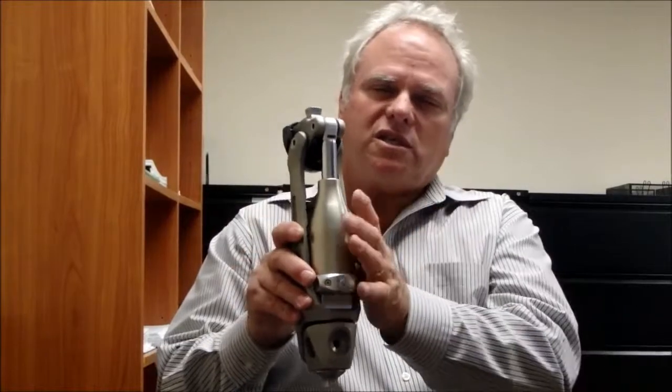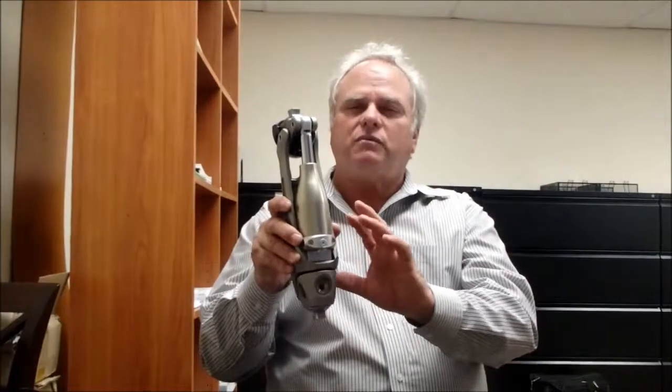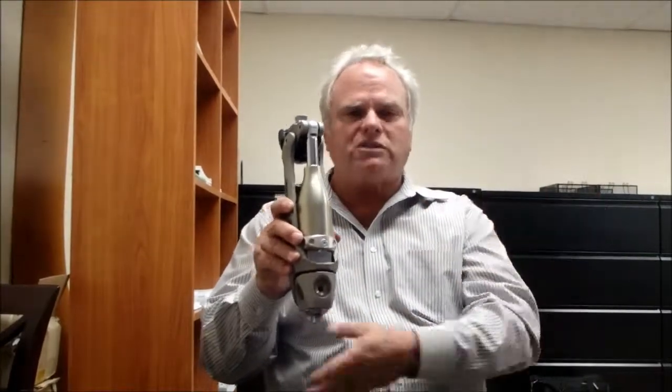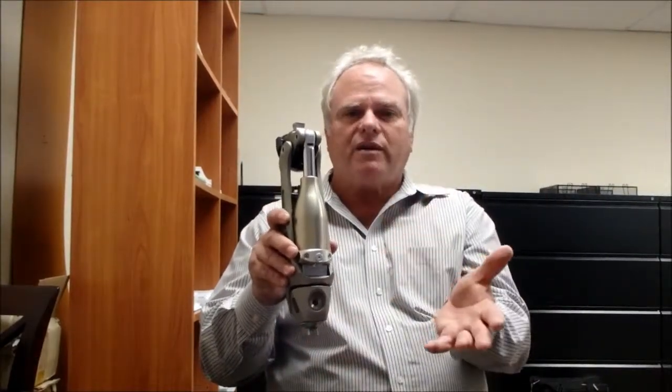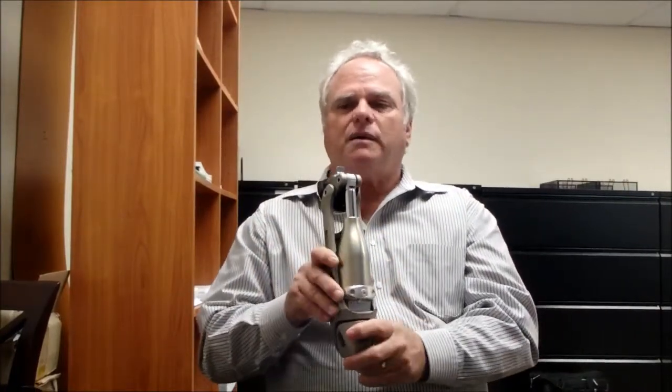The patient needs to understand that this is a different walking knee, and that the resistance is also their extension assist. So without a heel rise, they get no swing — the swing doesn't work. So those are the four steps.